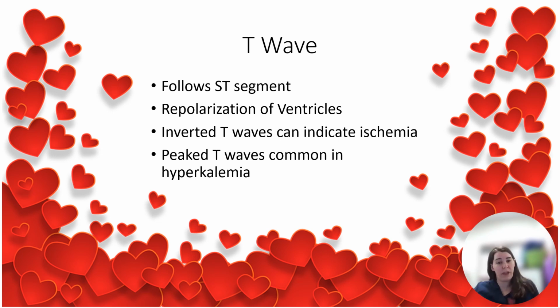Followed by our T wave, which follows our ST segment. It's repolarization of the ventricles. If we have an inverted T wave, it can indicate ischemia. And a peaked T wave is very common in hyperkalemia.